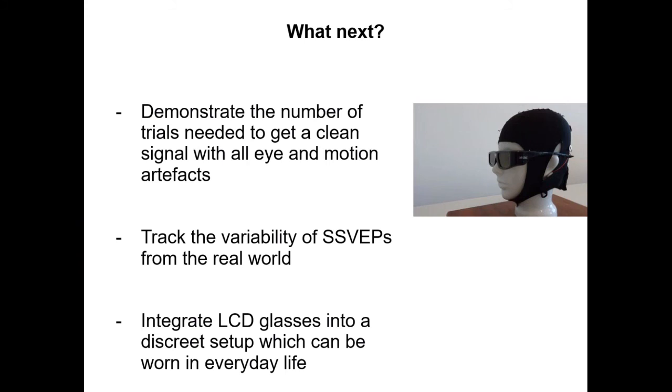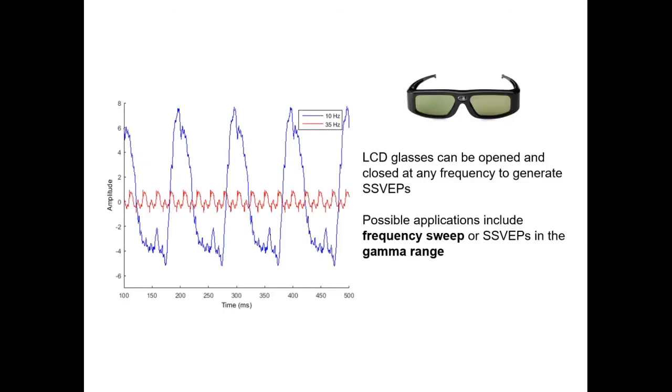And then we can combine this with a small, discreet amplifier which can be worn throughout the day without disrupting normal daily activities. So eventually we would like to have something that we could put onto people that they could wear and go out, spend the day exploring an environment or doing what they would normally do, and collect artifact-free data.